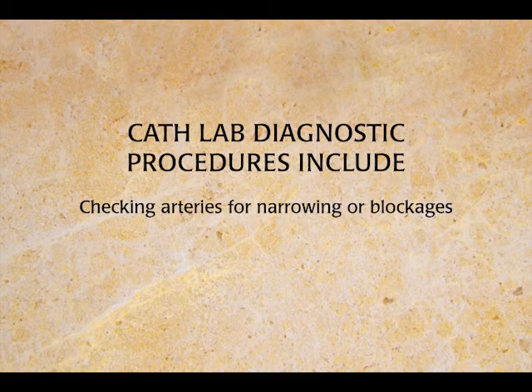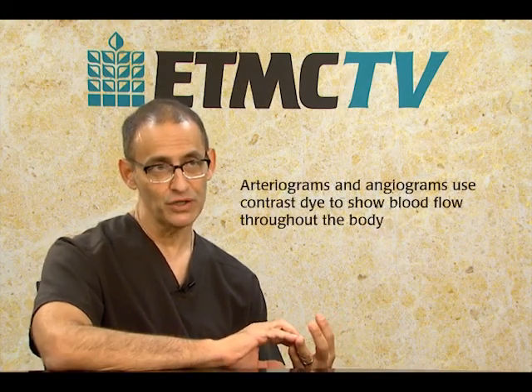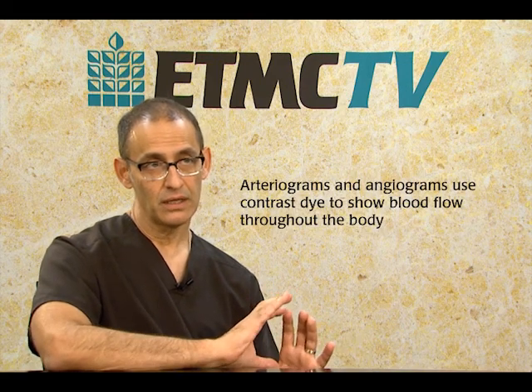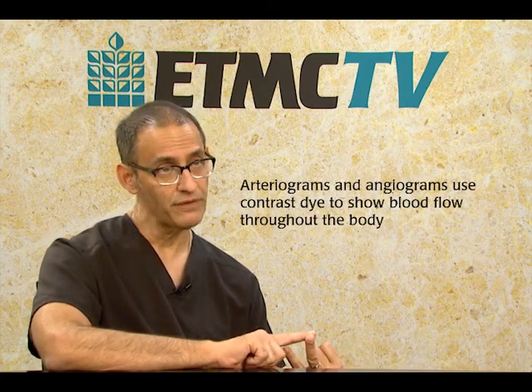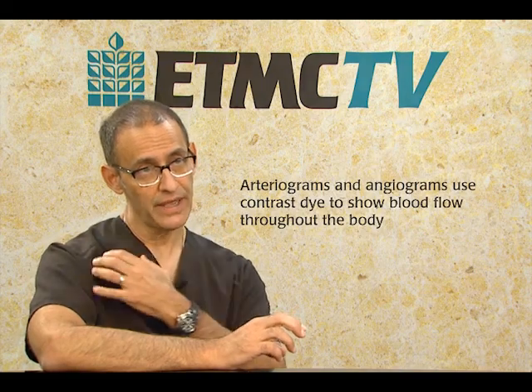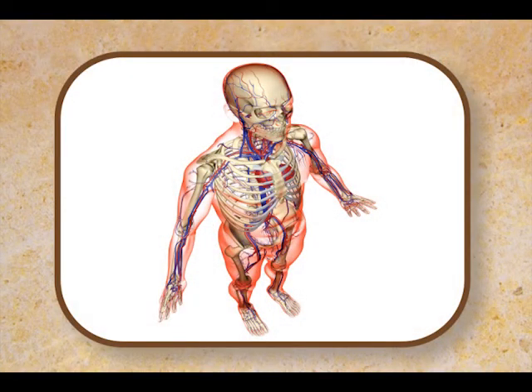If you look at the diagnostic side of the cath lab, what takes place there is right and left heart catheterization and various different arteriograms or angiograms which essentially outline the arterial blood flow anywhere from the coronaries to the aorta, the main blood vessel that leaves the heart, to the carotid arteries in the neck, to the upper extremity arteries, to the abdominal aorta, to the renal arteries, and then even down to the lower extremities, where we have the expertise as cardiologists to not only take those pictures, but also then to do interventional procedures on any set of those arteries, pretty much from the head down to the toes. That's just one aspect of it.